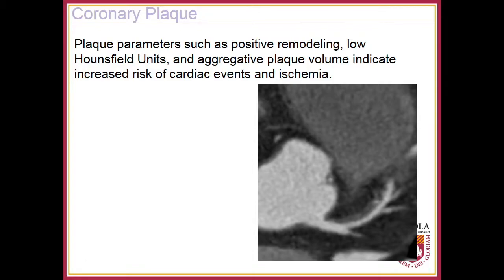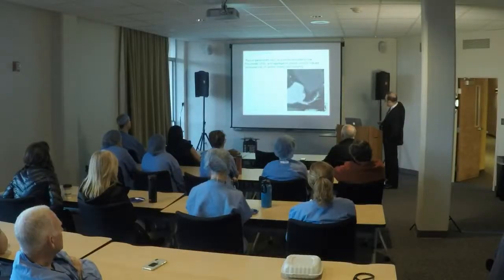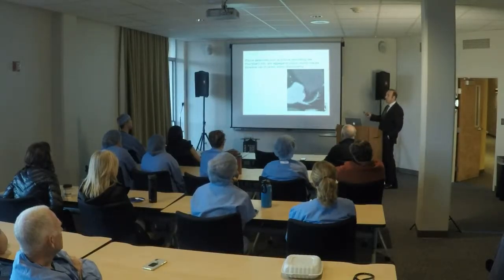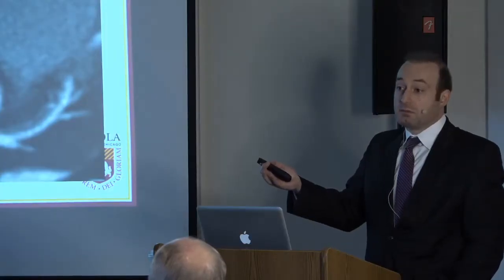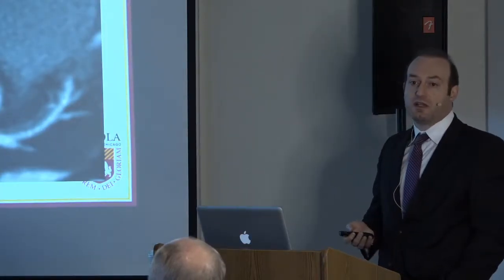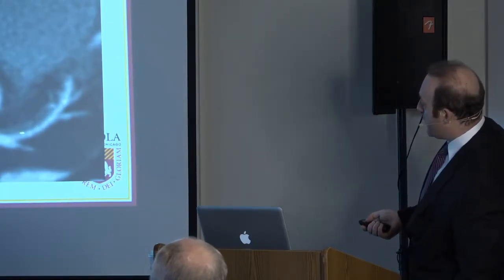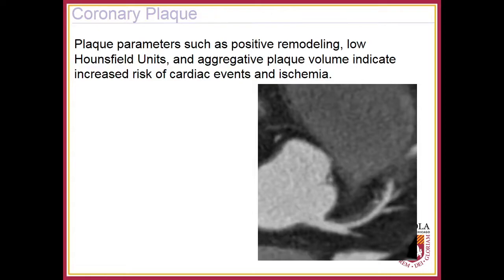And it may be hard to appreciate here, but this is the left main, and then this whole area right here is atherosclerosis, from the distal left main all the way down the proximal LAD. If you did a cath, you may just say, oh, well, there's no focal obstruction, small caliber vessels. It's just a small caliber LAD. Well, in fact, this is large plaque burden, and this patient's LAD was highly functionally significant, ischemic, and this patient underwent a LIMA.